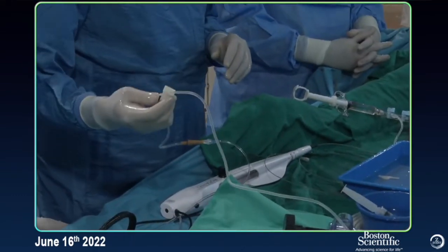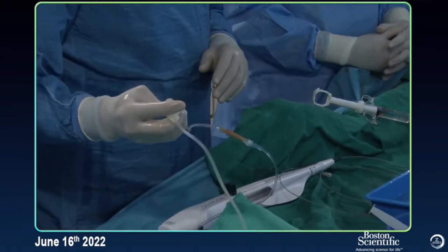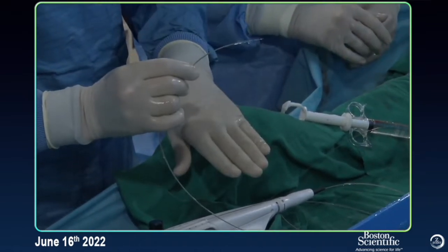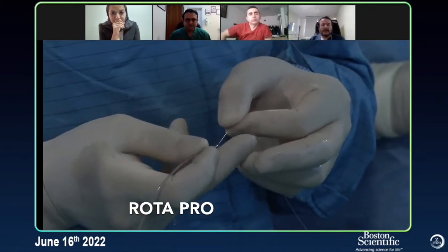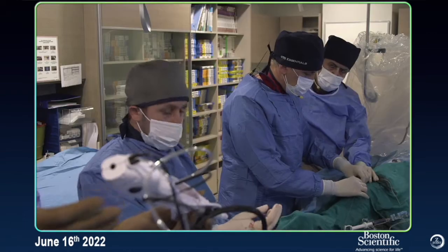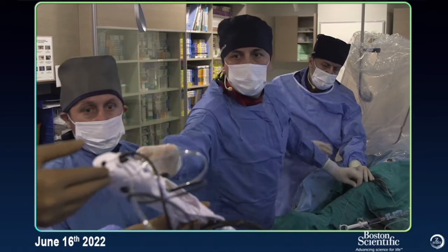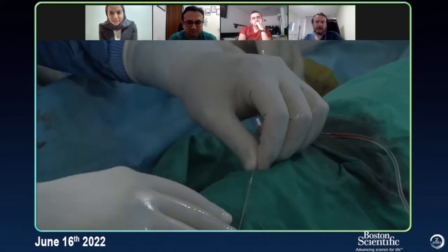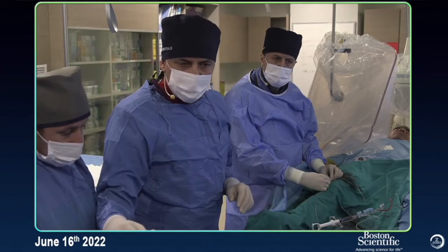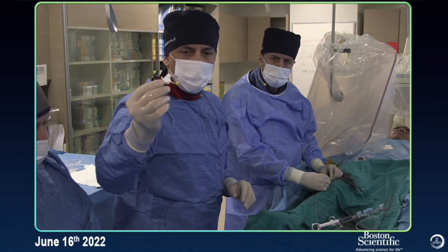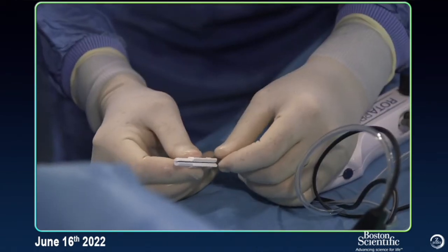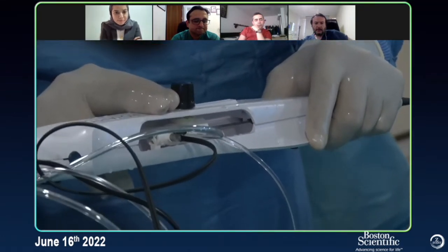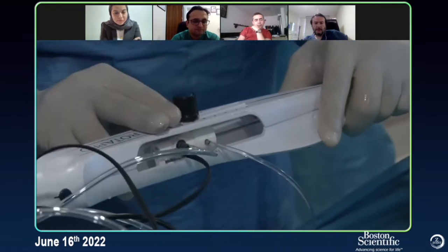I'll show you how we prepare it. We connected it with the liquid and we have to open and make sure the liquid is coming — this is important to see. Now I am inserting the Rotablator wire into the wire port. We're working over 7 French EBU by radial approach. Now I insert my burr. The wire clip is a very important tool — before testing, the wire clip should be set at the end of the wire. Before inserting, we have to get ahead of the rail by two finger-widths to get room for pulling it back.